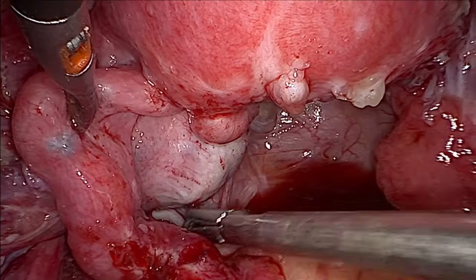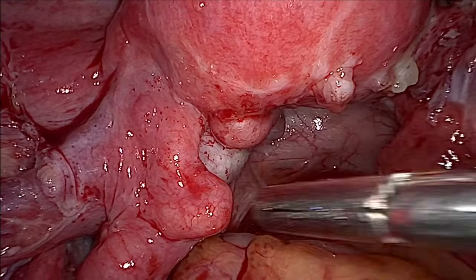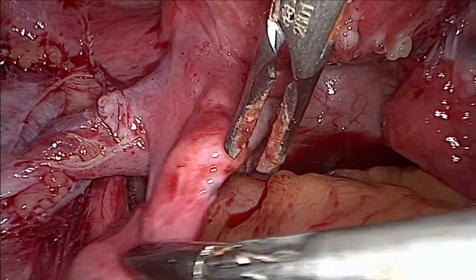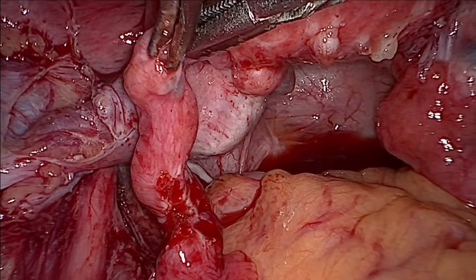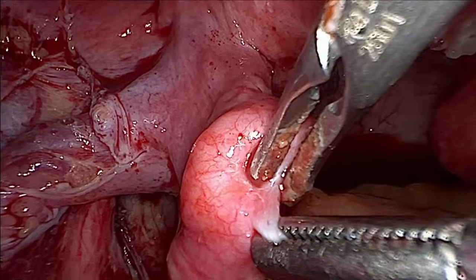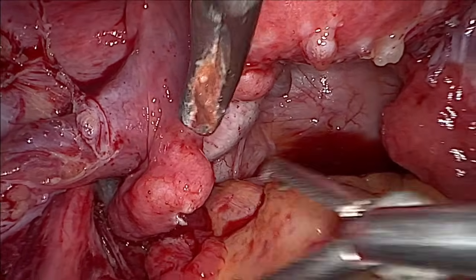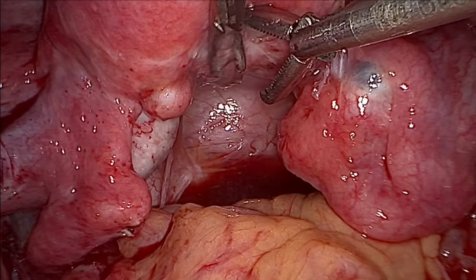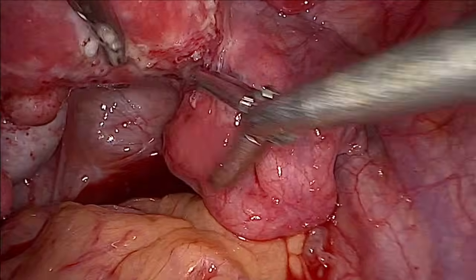We will test the tube, of course, but the tube is not looking very healthy. It is a bit kinked, and you can see the kink here. Because of this endometriosis there is this small kink. Right now we are not going to do much about it. We'll first concentrate on the peritoneal part, and we will test the tube. If the tubes are open, we won't be doing anything for now.